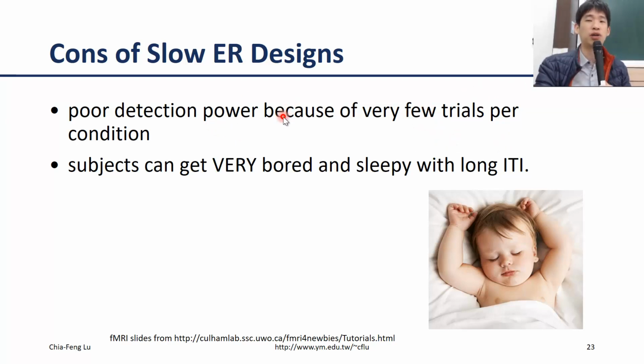So the detection power becomes very low. And also, most of the subjects may just fall asleep during the scan, because it's very boring. Maybe only 10% of the scan time the subject needs to do something, but the other 90% all they need to do is relax, and relaxing means it is very easy to fall asleep. Okay.